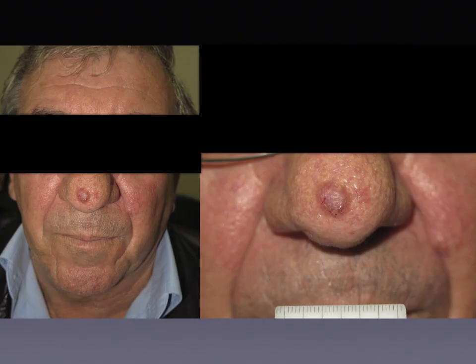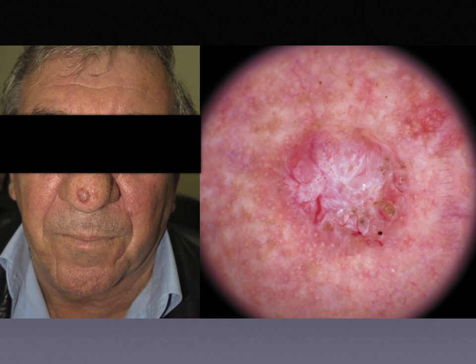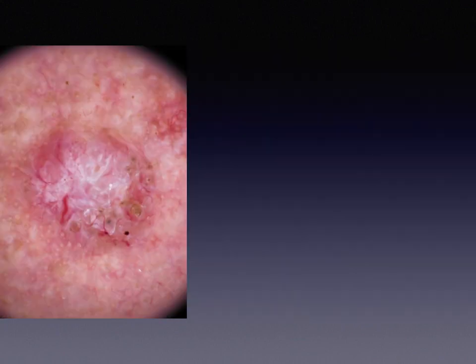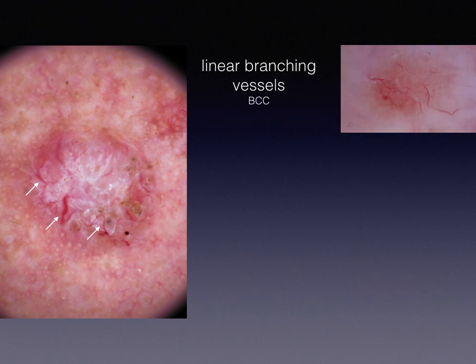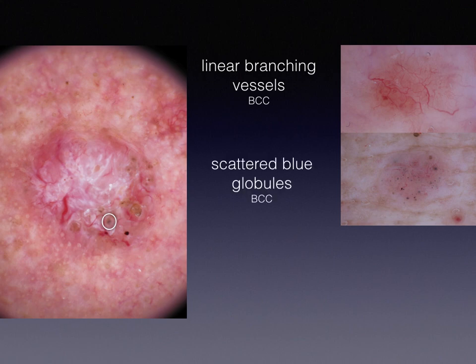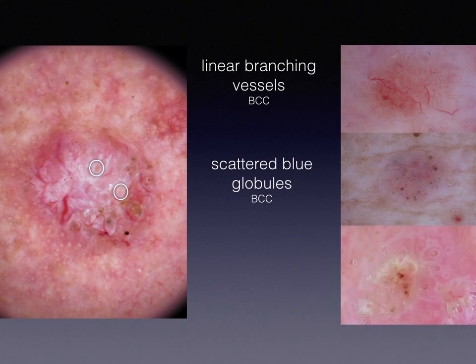Let's look at a couple of examples. The first is a nodule on the nose. On dermoscopy, we can see linear, arborizing branching vessels — a BCC clue — and also at least one blue globule or blue dot, again a basal cell carcinoma clue. But in the upper part of the tumour, we can see follicles surrounded by white color — white circles surrounding follicles — which is a classic clue of squamous cell carcinoma.